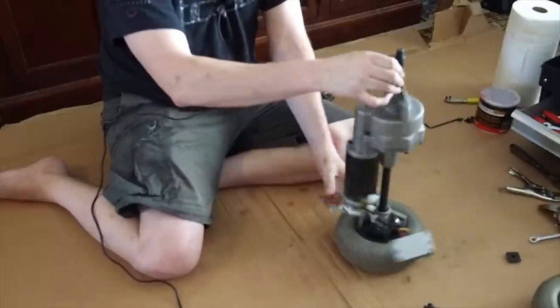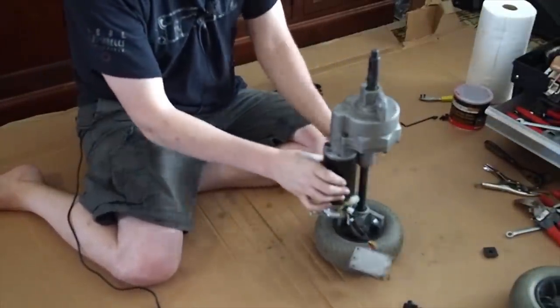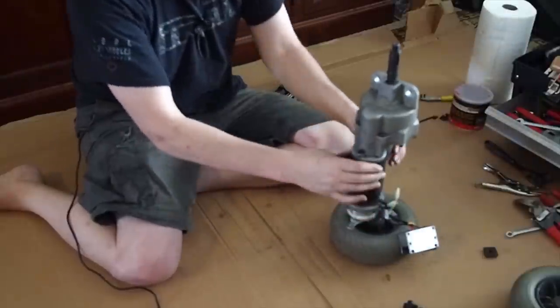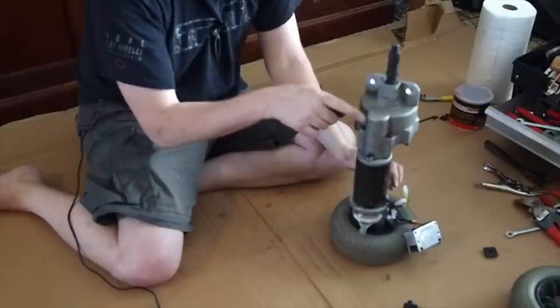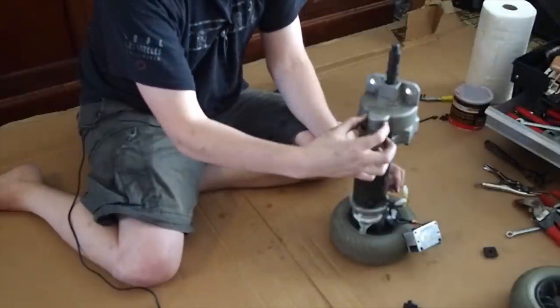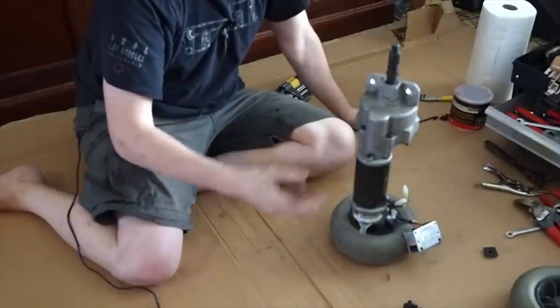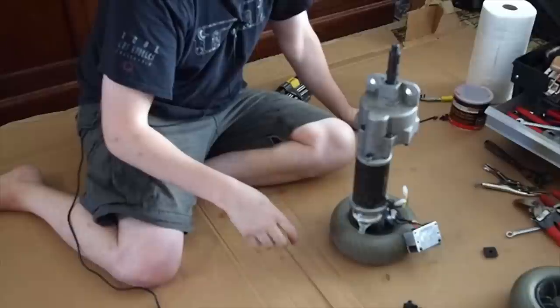So the next thing is I'm going to take the motor off of the transaxle. That is these three bolts here. I don't think there's four. Yeah, it's just these three bolts, and that'll slide the transaxle down. The part that was broken is actually right in this section here, the one that I replaced. This right here is a bearing that looks very similar to a skateboard bearing. In fact, I'd say it is one, but it's a sealed bearing. I'll show it to you when I take this thing apart.